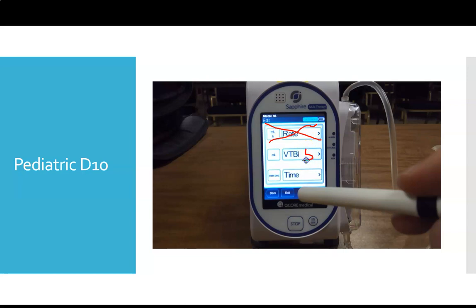We know that we want to give 50 milliliters, right? So if we know we want to give 50 mLs, we're going to check this one off because we now know the volume to be infused. Don't be confused that you have 250 mLs of liquid in the bag. You know you want to give 50 mLs of that. So your total volume to be infused is 50 mLs.